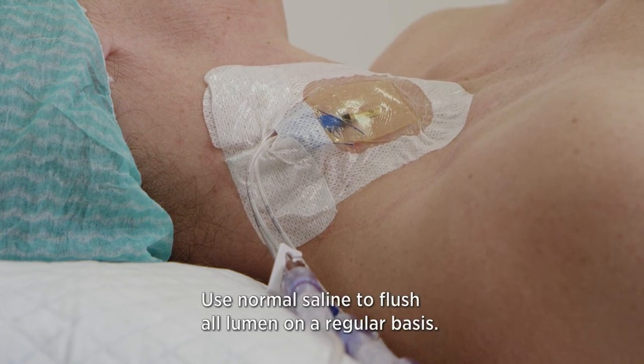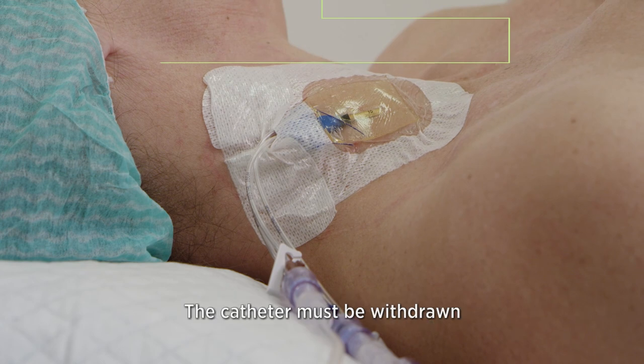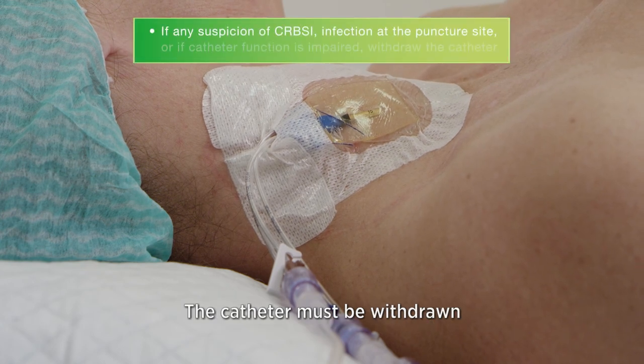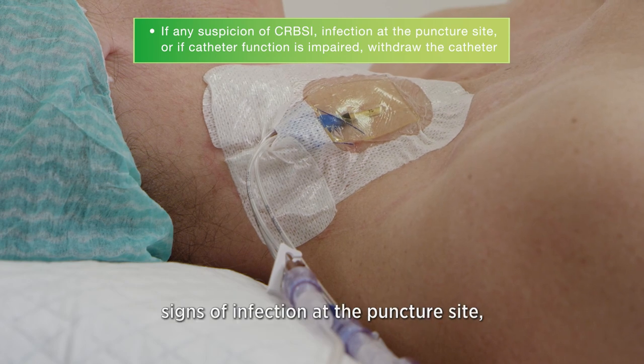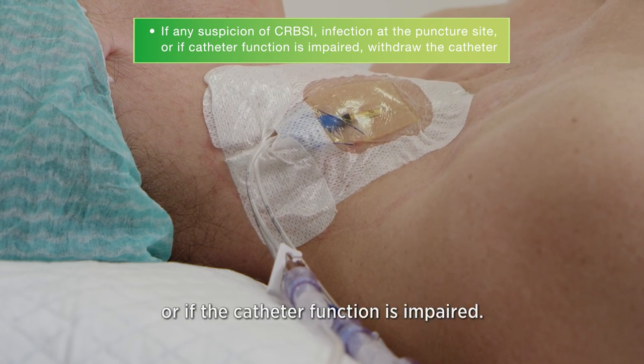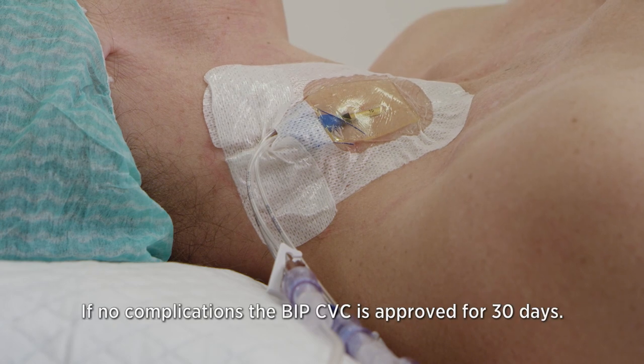Use normal saline to flush all lumens on a regular basis. The catheter has to be withdrawn if there is any suspicion of catheter-related infection, signs of infection at the puncture site, or if the catheter function is impaired.